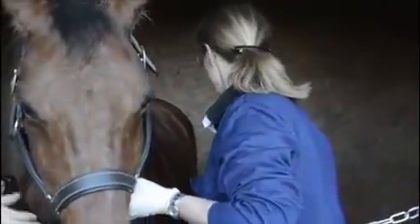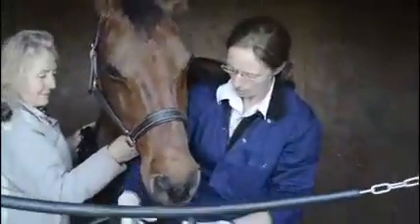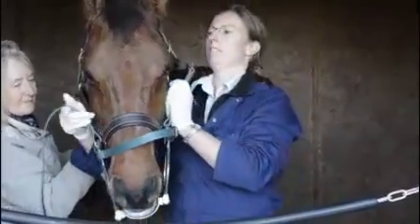So we'll put the gag on, and we'll see how we cope with this, and just make sure he doesn't knock you. Okay.